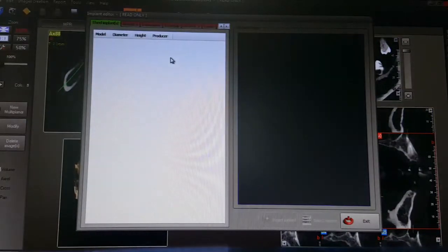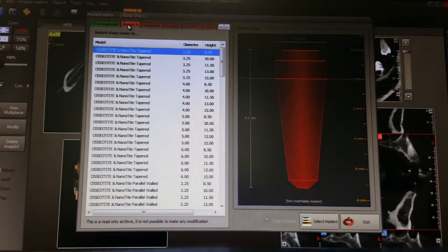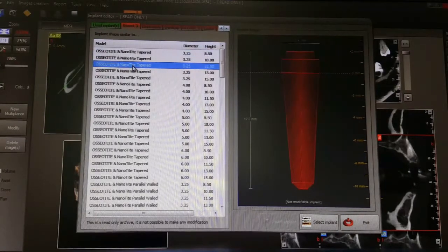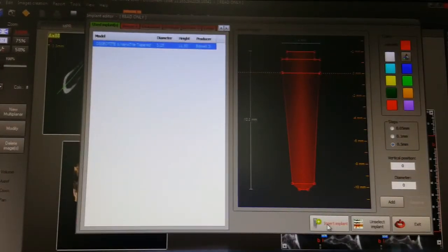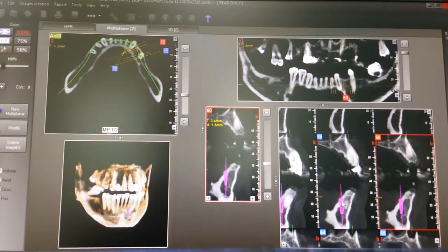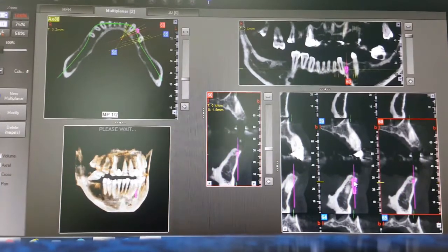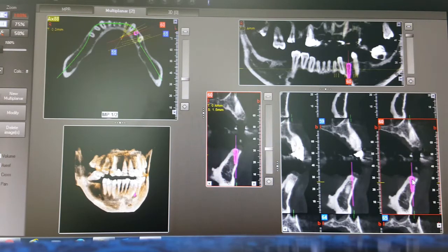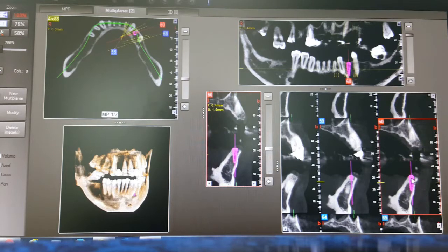To place the implant, go to Tools, then New Implant. Choose the manufacturer — for this example I am choosing 3.25 by 11.5 mm. Select implant, then Insert Implant. The implant now appears on your cursor and you can place it as you like. Here you can see the implant placement, visible on the panoramic view as well as the sectional view. Let's take it slightly inside — and the implant is placed.